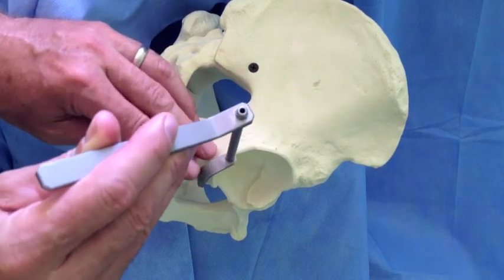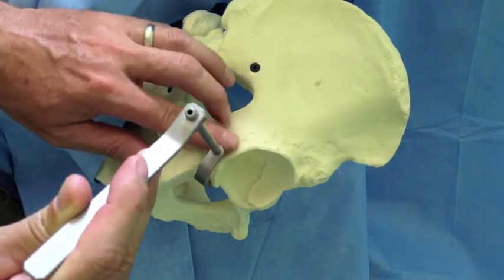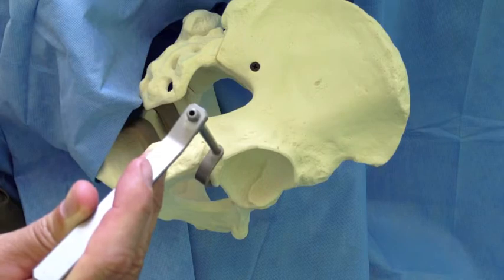The tip of the drill guide itself is then brought up and over the posterior rim of the socket to sit on the posterior wall. Care should be taken to ensure that no soft tissue is interposed between the drill guide and the bone.